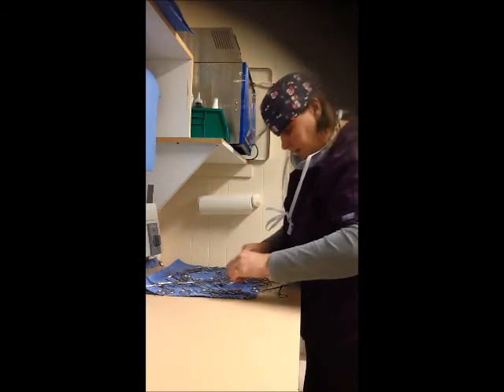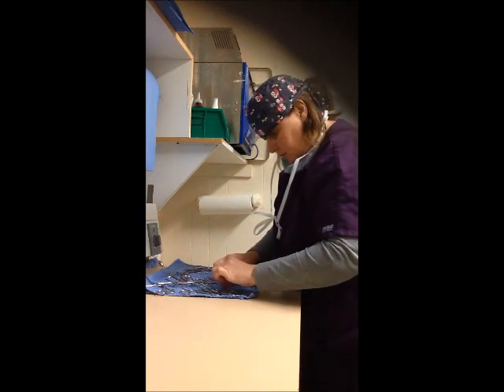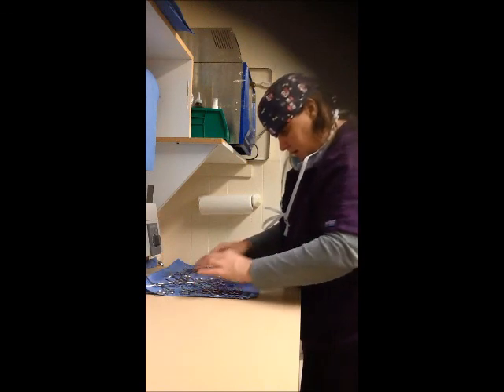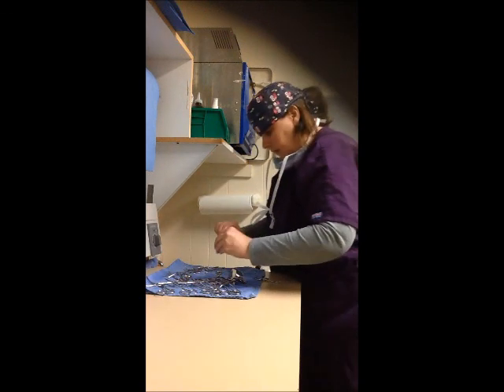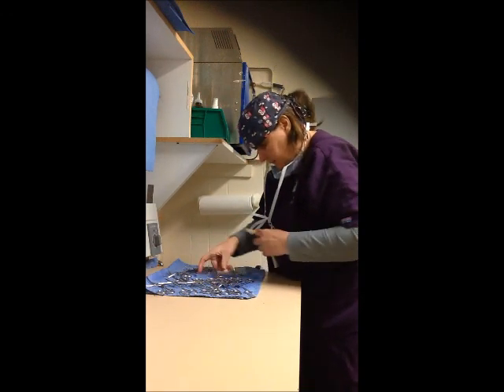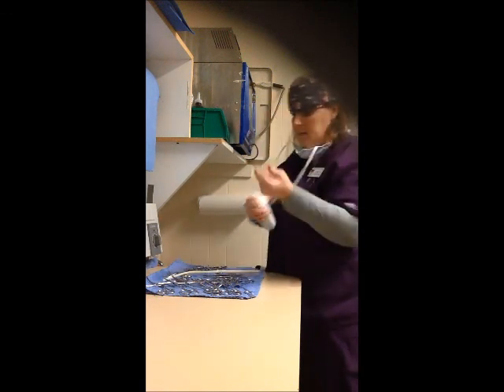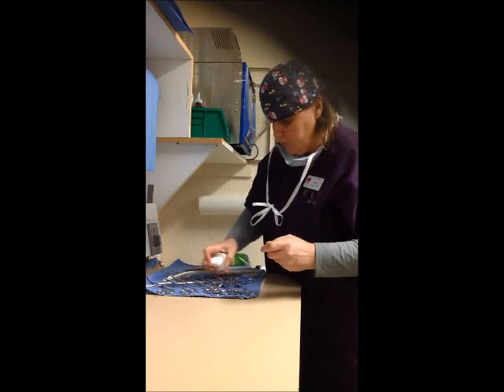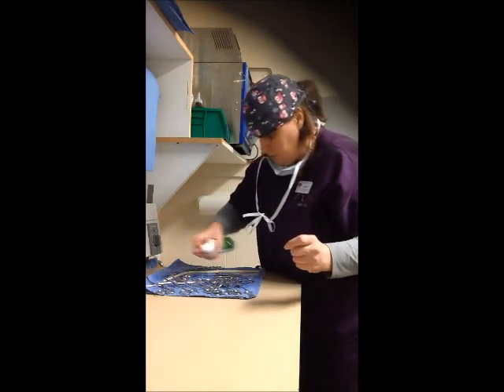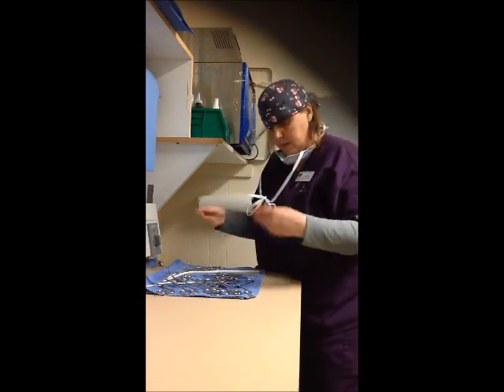So our laceration pack is a smaller pack than a small pack or a large animal pack, because most of what we need is just for laceration repair or any kind of wound repair, dog bite, cat bite. Then I'm going to spray on the surgical spray into all of our instruments, and then let it sit and dry.